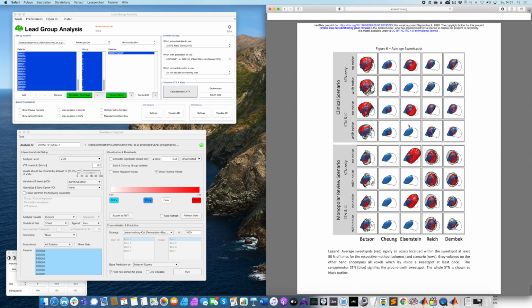Just to show you one figure, this one highlights different approaches that have been used in the literature. Till has helped us greatly in putting the general ideas of these approaches into this tool. There's a lot that can be said here, and we'll go through each part of that in a second.